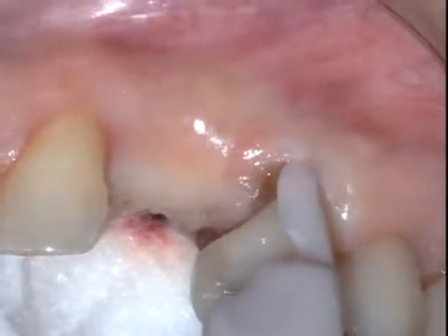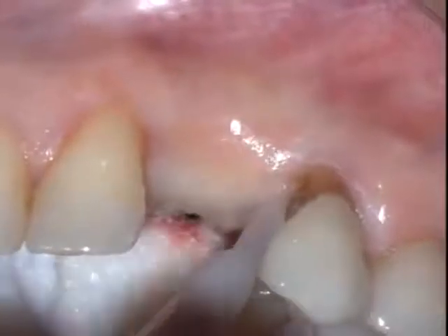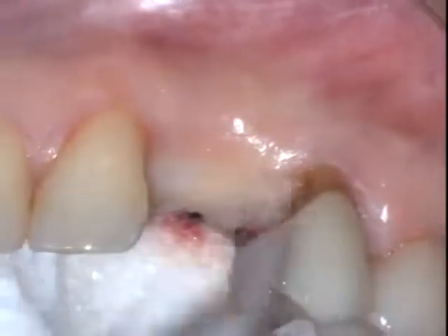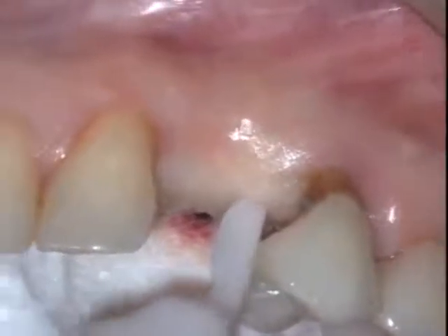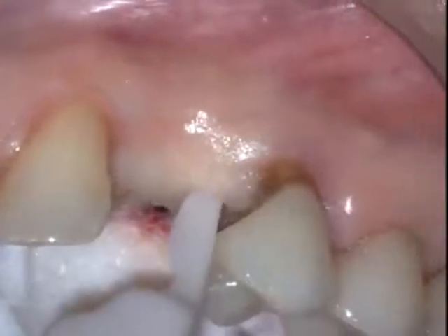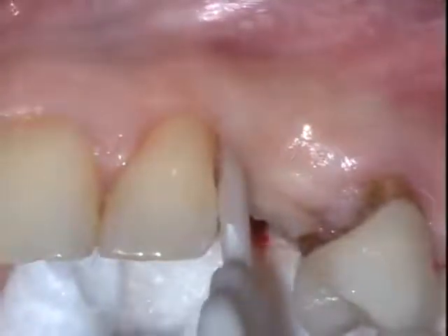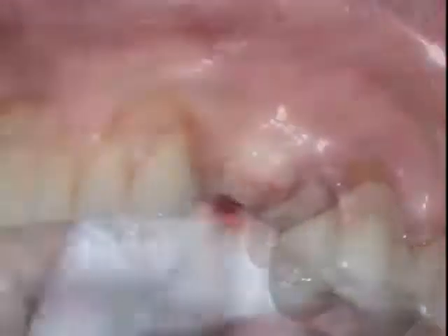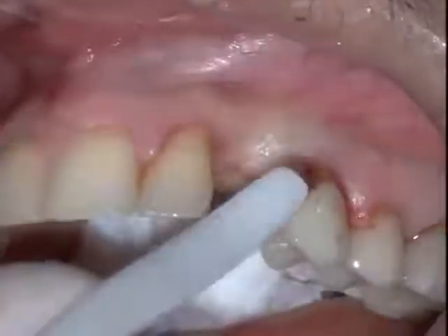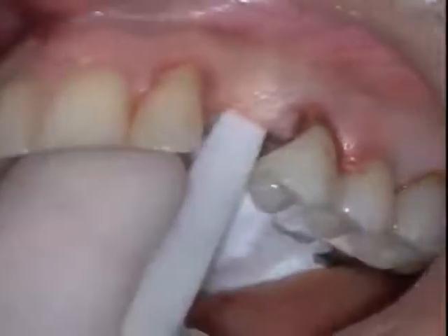This patient was very clear to us to avoid the utilization, when possible, of any metallic instrumentation of stainless steel or even titanium. The zirconium blade here is utilized to make the sulcular incision and approach to gain access to the recipient site. Crestal palatal incision is utilized to split the keratinized tissue to make sure that we have keratinized tissue on both the buccal and palatal aspects. Circular, circumferential, sulcular incisions are then utilized around the lateral incisor and the first bicuspid.